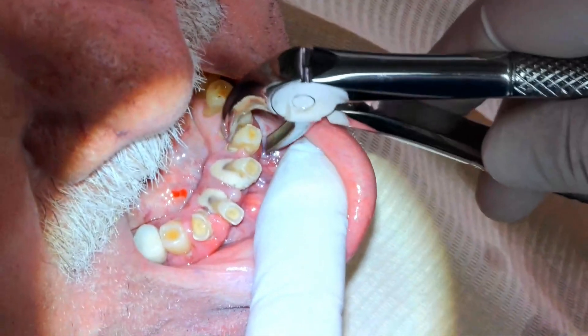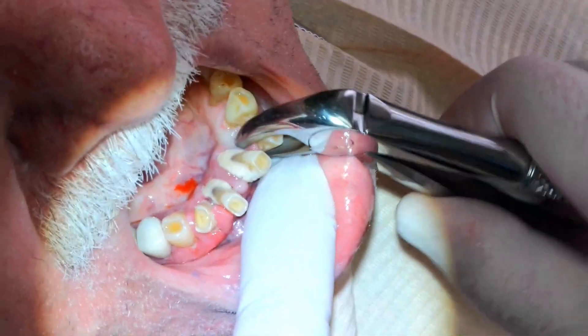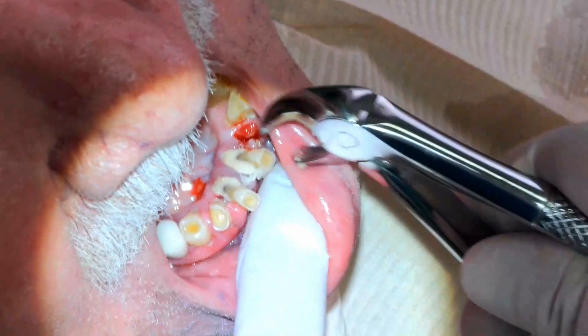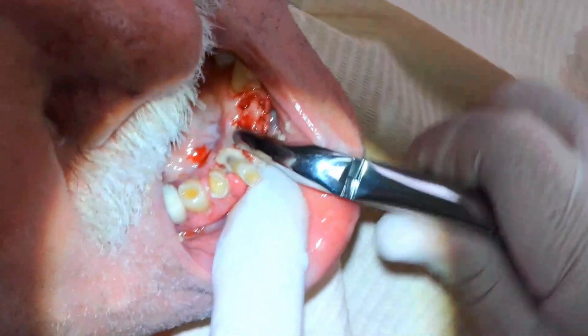As you can see, there's all that schmutz on the teeth. There's just a lot of plaque and tartar buildup. These teeth are very loose on the x-ray. There's very little — there's no bone holding them in. It's basically just the soft tissue.